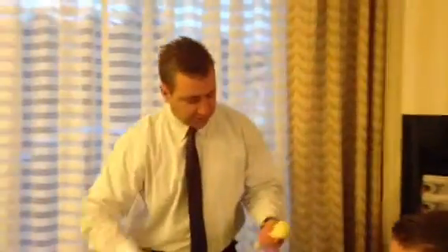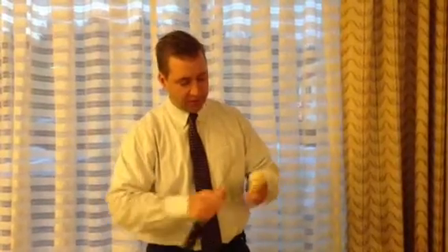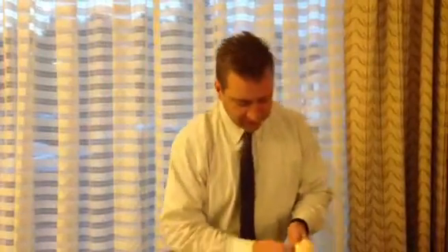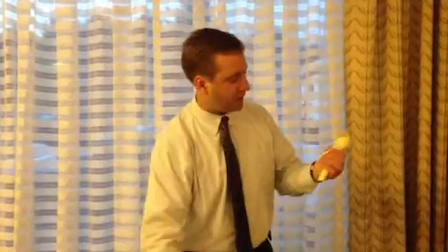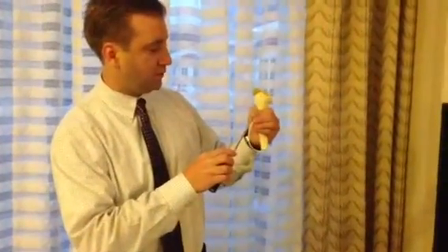The alternative technique they do with this — similar to the Arthrex for an open case — is a one-sided technique. Take a look at your technique guides; they talk about it there. The benefit of the one-sided technique is you probably get a little less tendon spin. You prep your graft, then place your tendon fork within a little suture loop there.